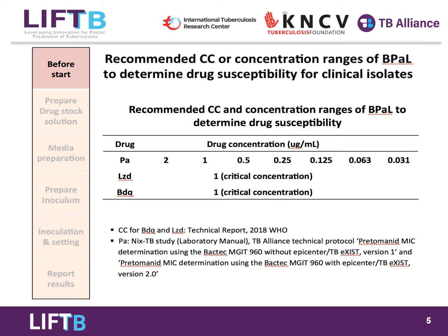This material does not cover determination of pDST of clinical isolates toward pretomanide using the MIC assay. However, after you assess pretomanide pDST using the reference MTB strain H37Rv, you can begin testing clinical isolates. You can follow the procedure described in the following slides to obtain reliable pDST results for pretomanide using the MIC assay for the patient samples.